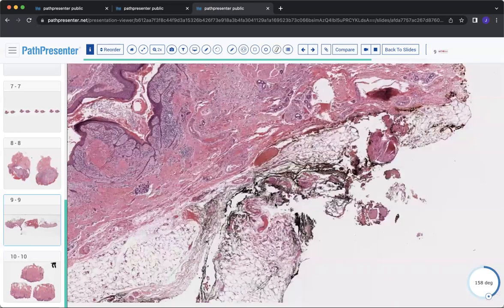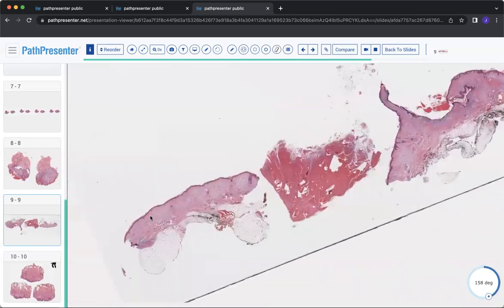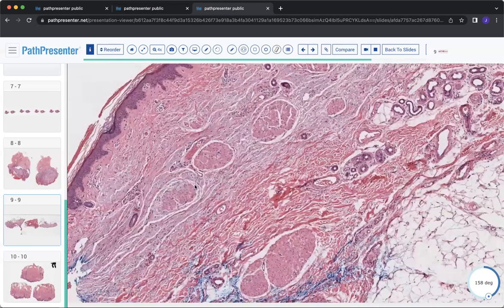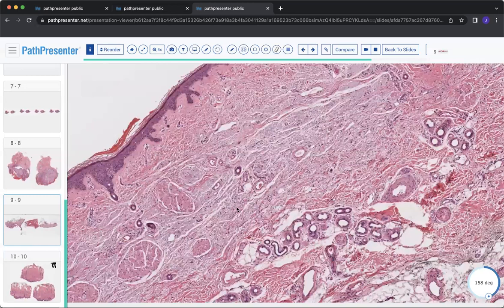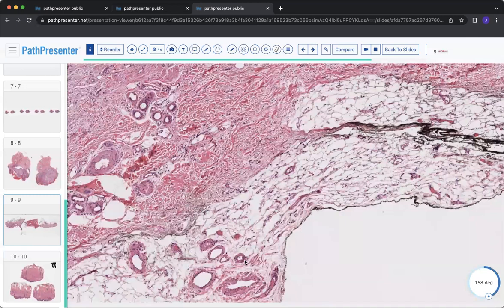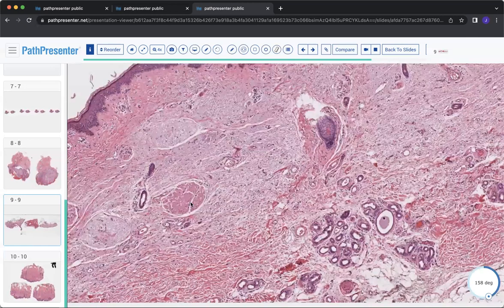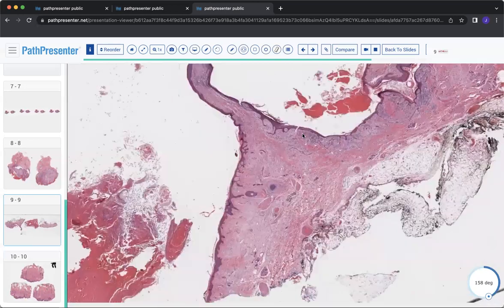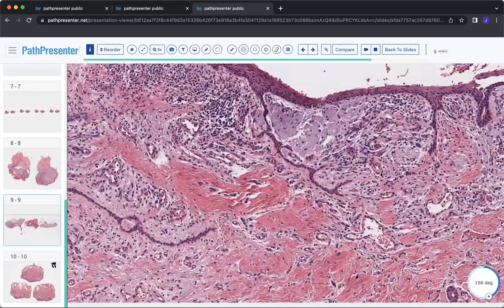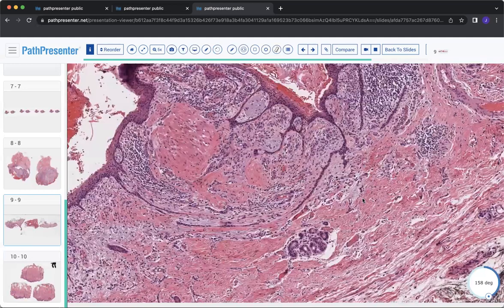Now, depending on what section you're looking at, you may also not see a ton of other diagnostic criteria. So if you look over here, you're going to see really just cross sections of arrector pili muscle, or erector pili muscle. You're going to see eccrine glands, subcutaneous fat, nothing that really jumps out, right? And so that's a reminder to definitely look at the whole slide, see if you can pick up on any more clues. And this type of design here should give you this trichodiscoma or fibrofolliculoma vibe. All right.